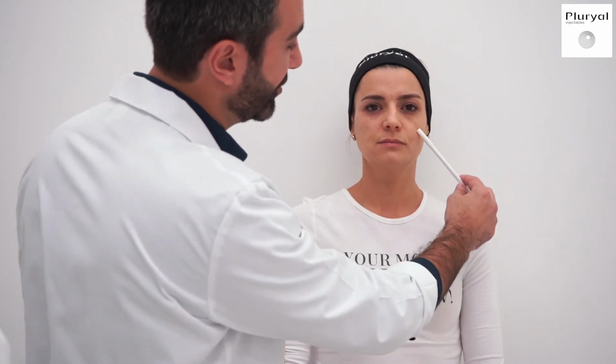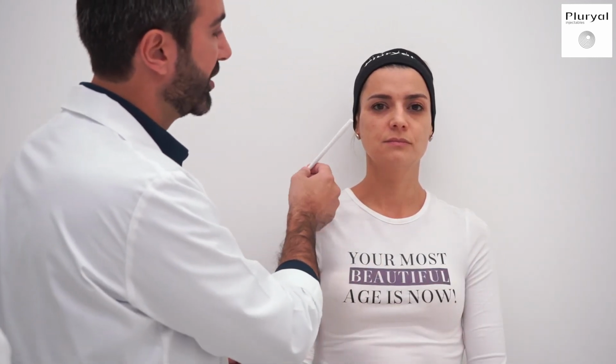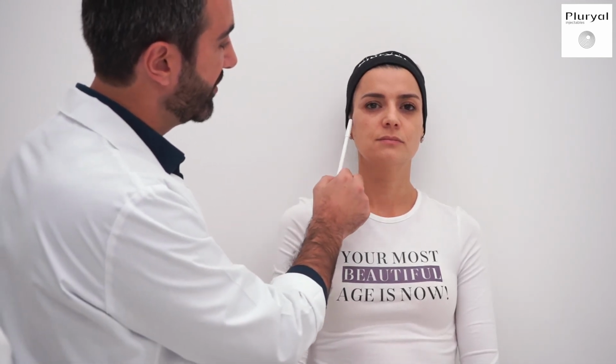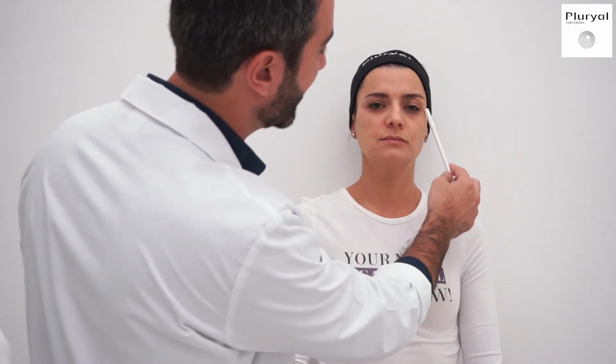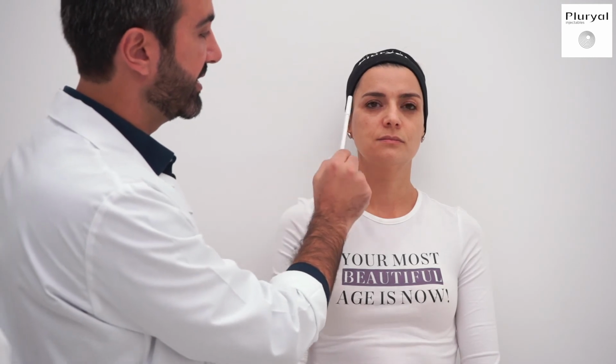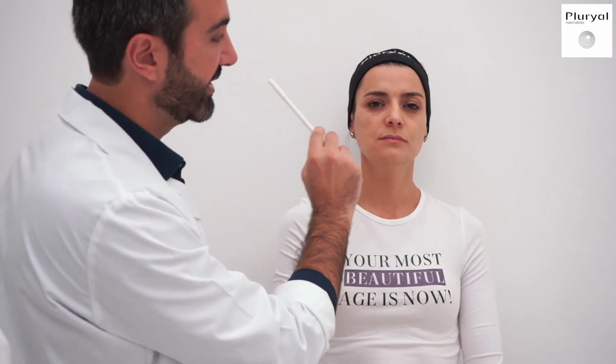We have now treated half of her face. She looks much more healthier now. The nasojugal groove disappeared. Her whole eye seems wider and nicer. She has now higher cheekbones that she lost here. Her temple area is also much nicer.